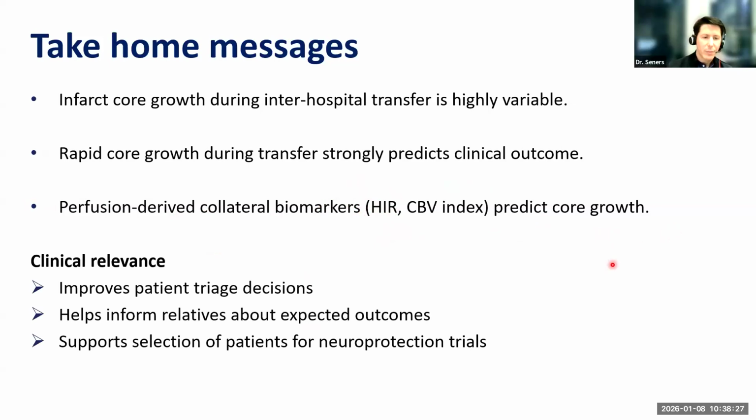It can help to improve patient triage decisions, whether or not we should transfer a patient. It can also help to inform the relatives about the expected outcome and lastly support the selection of patients in our neuroprotection trial. Thank you very much for your attention.